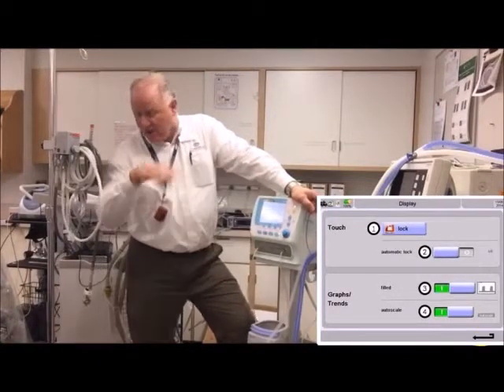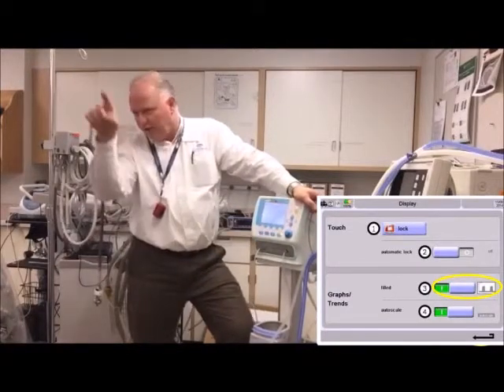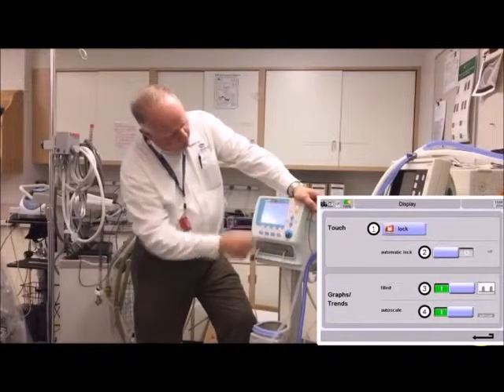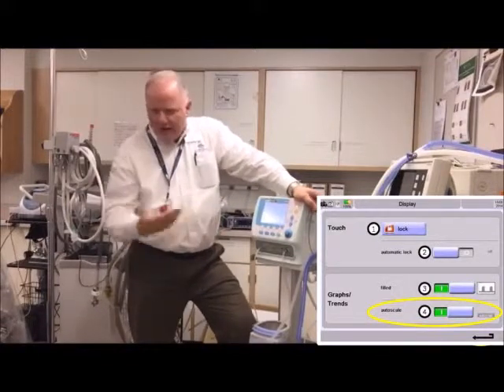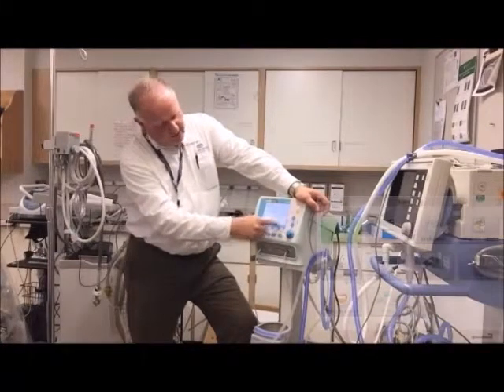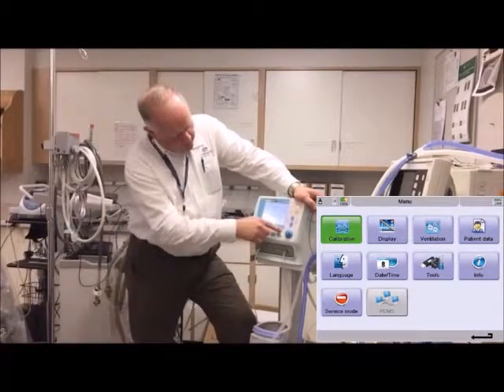The waveforms are normally solid filled in, but you can switch them to a dotted outline if you prefer. You can also set auto scaling for the waveforms, or if you prefer to adjust the scale manually, touch the screen and a little icon shows up in the corner to let you do that.